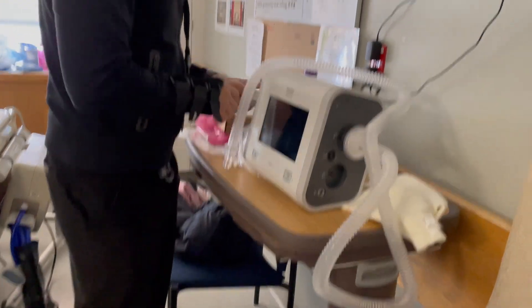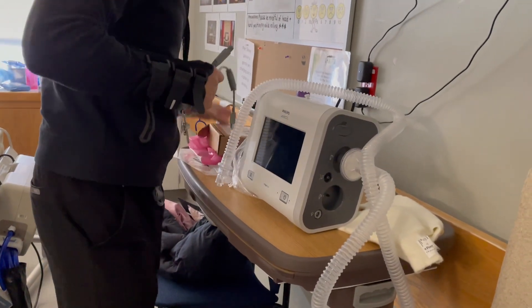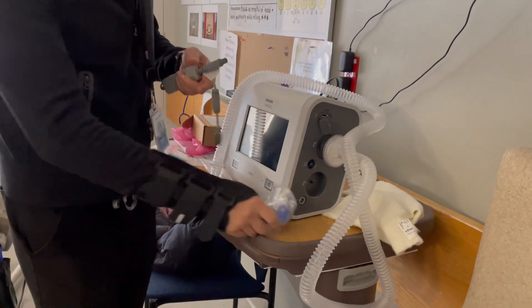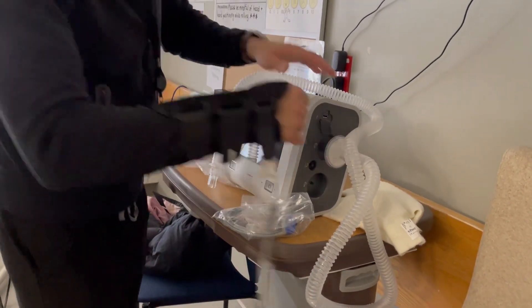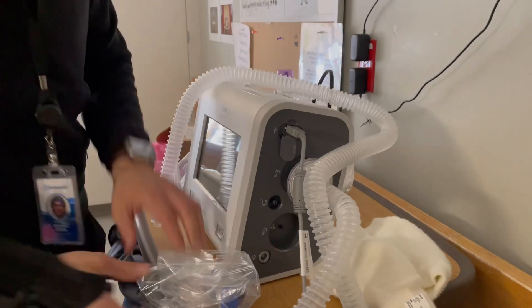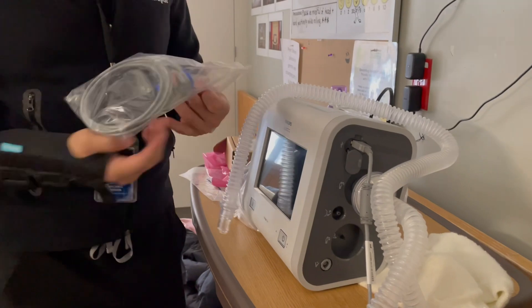And we've got more — two pieces here. This comes here, it's a USB drive, and this.